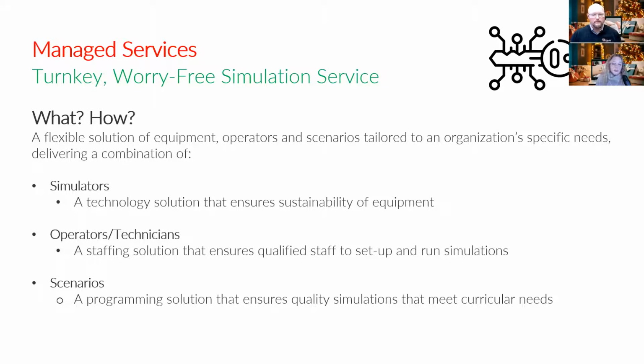So what do these services really offer? One of the main things is the simulators. One of the parts of this managed service includes the technology, the LEAP software that is included with that. So everything that really makes the simulators work. The other great part is operators and technicians.